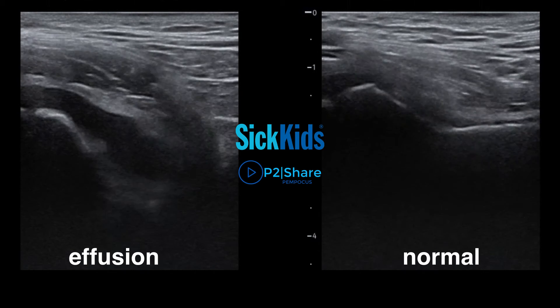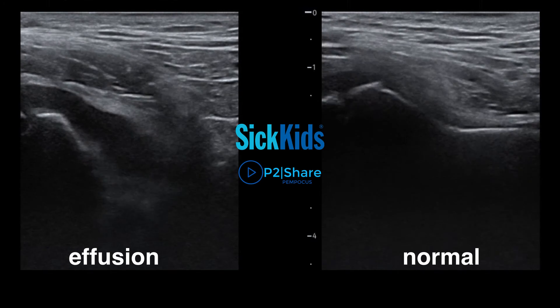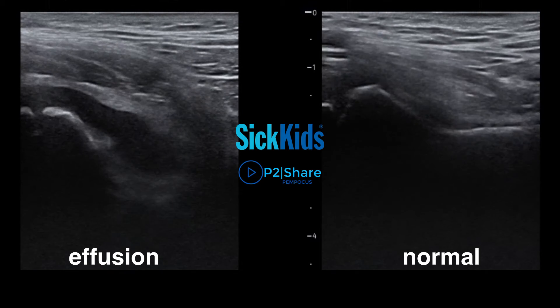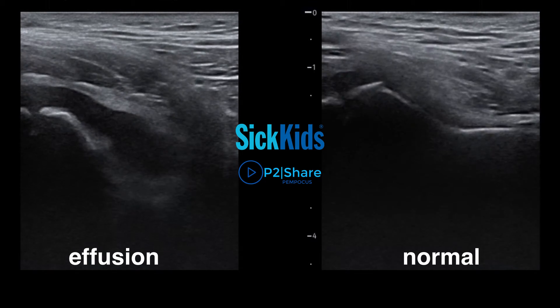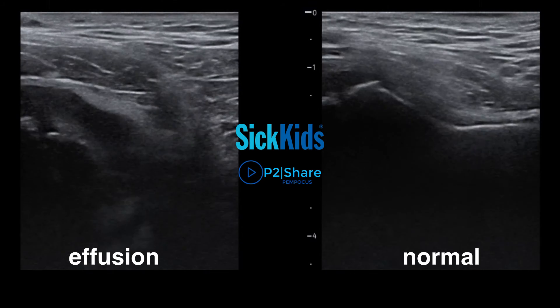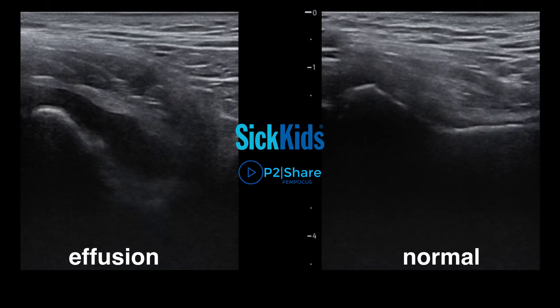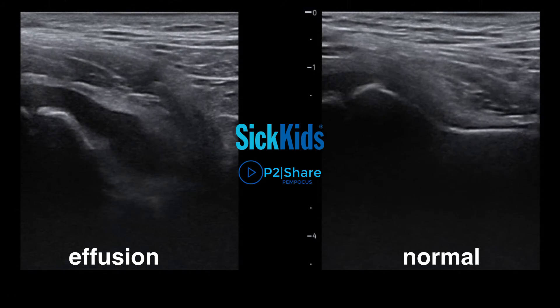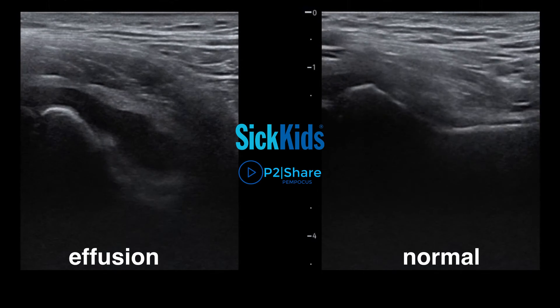To see whether the patient has a hip effusion, look at the femoral neck and the iliopsoas muscle next to it. You're looking for a hypoechoic fluid collection in this area. The measurement is taken at the level of the femoral neck — if the fluid collection is more than five millimeters on the affected side, or if there's a two millimeter difference compared to the unaffected side, it is considered a pathologic hip effusion.